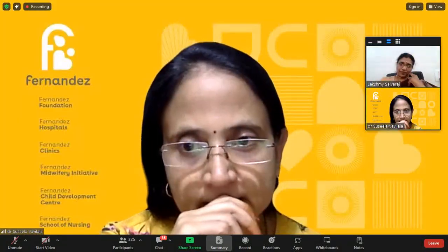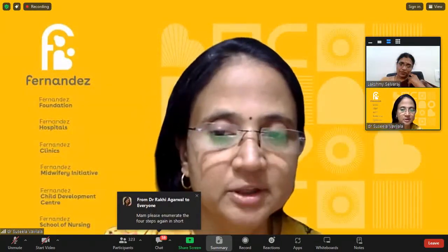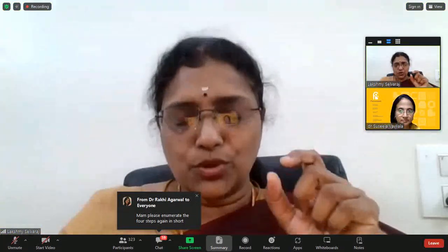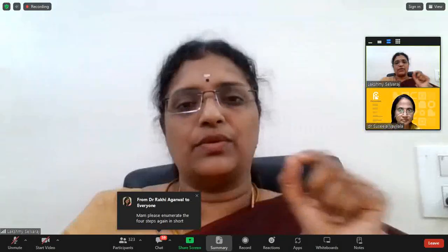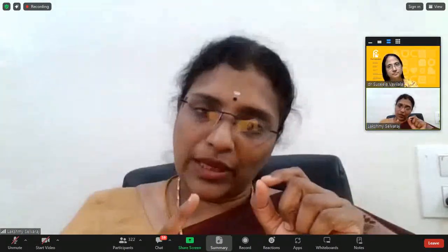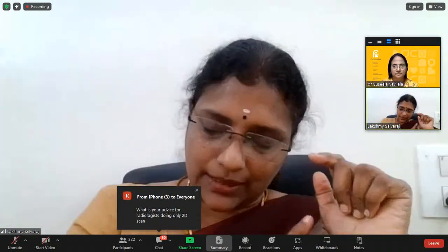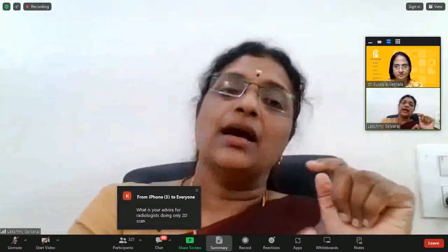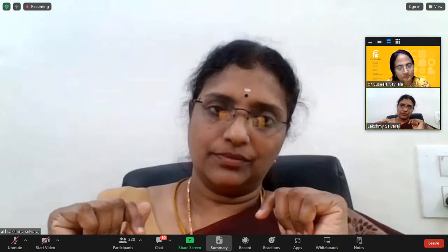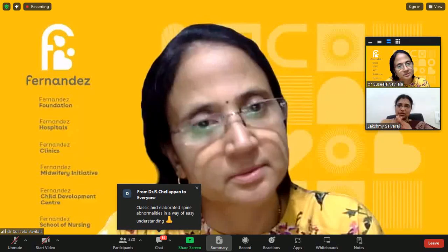Ma'am, is it possible to have an isolated low conus distance with no spinal defect? Again, that's what I said. You should not rely on one parameter, which is the conus distance. The conus distance is only an adjuvant. If I identify a low-lying conus, then I just measure it to supplement it with the conus distance. But I would obviously see whether there is a tethered cord or not. I think that exercise should be complete to label it as a tethered cord syndrome.